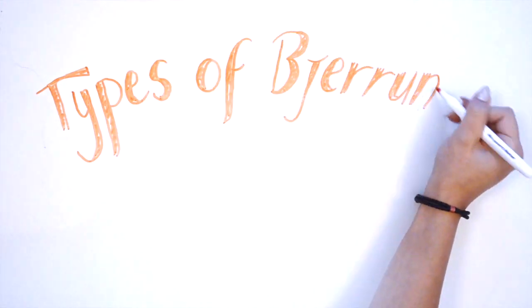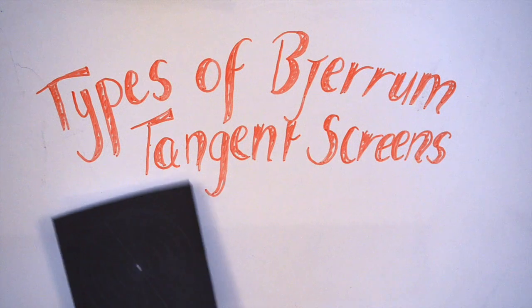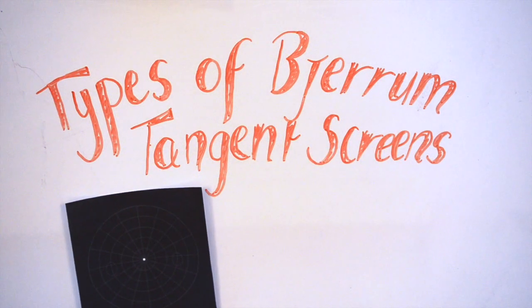The extent of the Bjerrum visual field maps out an individual's 25 to 30 degree visual field. In some instances, if the patient cannot see the central white target, the Bjerrum is modified to meet their visual requirements.